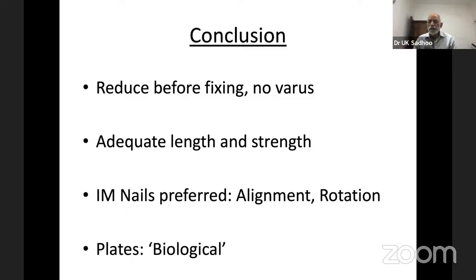It preserves whatever precious bone is left. And because of those slightly raised side fins, you automatically get rotational stability. So blade plate is a magic implant. I know it is difficult, but once you get the hang of it, it will save your life at many times. I'm a great fan of blade plate.